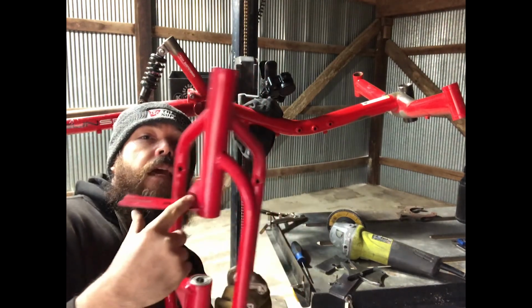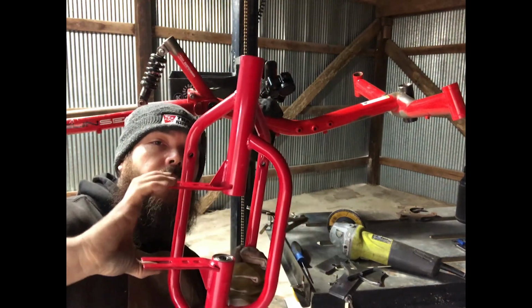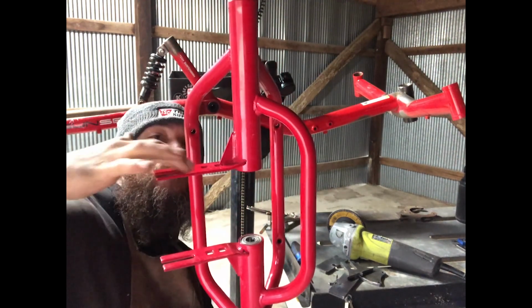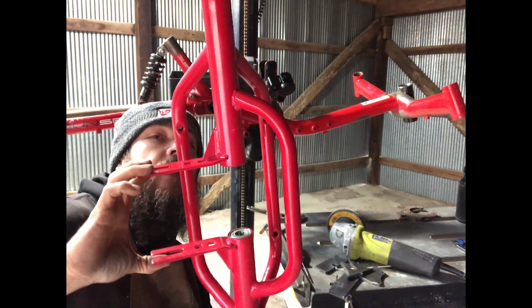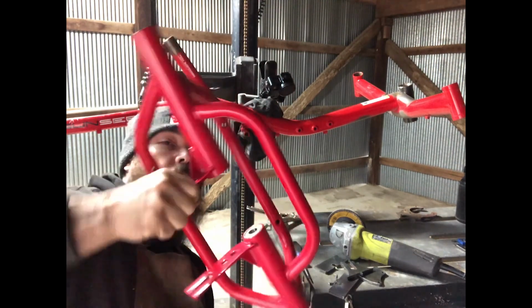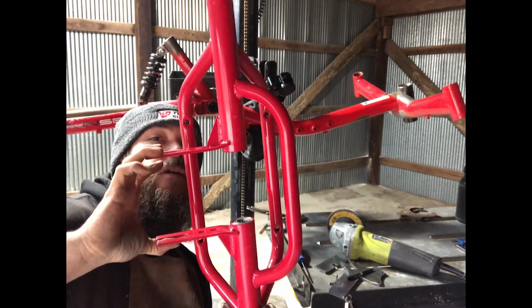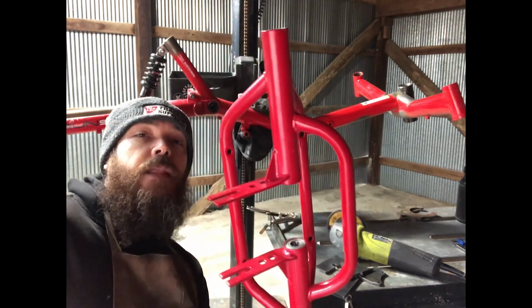And this, see, they had to put this brace in here because normally all the weight of your bike is on these two little pieces here, and because they're so long, they're kind of actually flexy. And when you get rock crawling or moving around, it's going to want to twist this in here. And so that's why I'm going to weld mine into place.